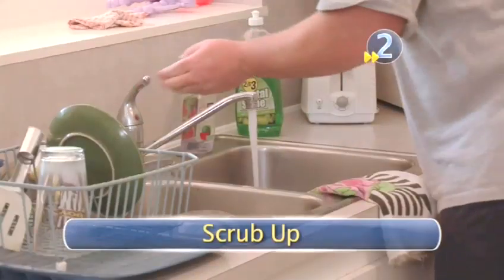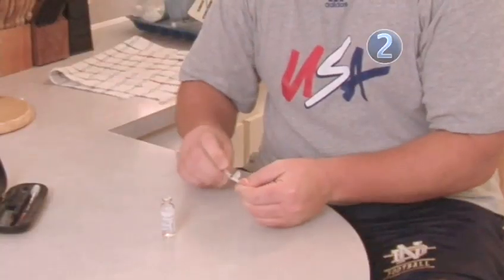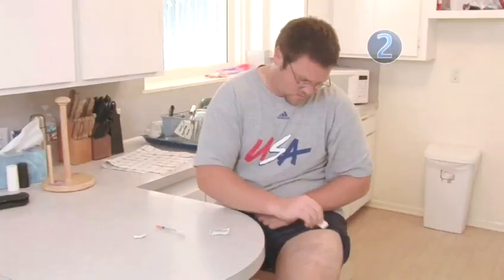Step 2: Scrub up. Wash your hands and dry them thoroughly. Then clean your injection spot with the alcohol prep pad. Let the alcohol dry on the skin so it doesn't sting when you make the injection.